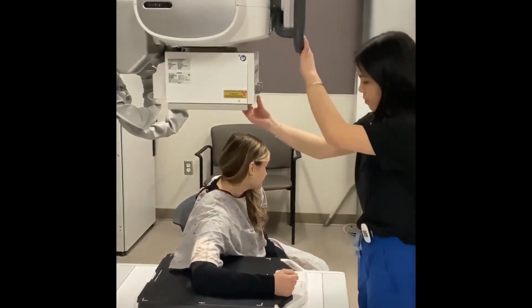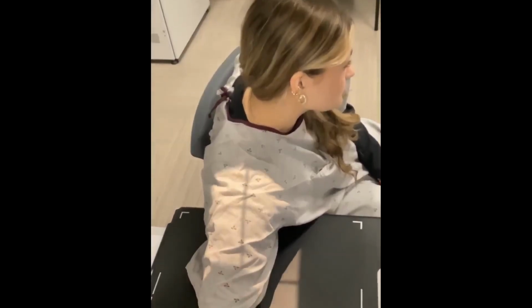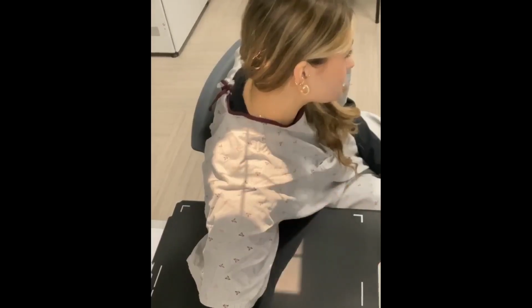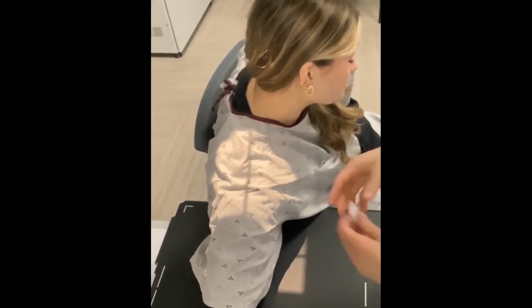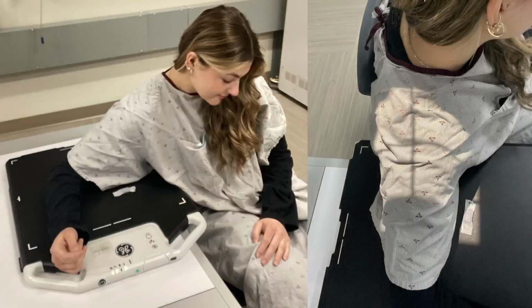Ensure there is a 40-inch SID and a central ray angled 5 to 15 degrees medially. Ensure that the central ray is entering superior to the shoulder joint and directed inferiorly through the glenoid humeral joint. Mark the affected side. The shoulder joint is positioned parallel to the IR with the humerus in a neutral position. No shielding is used per current Bontrager guidelines.